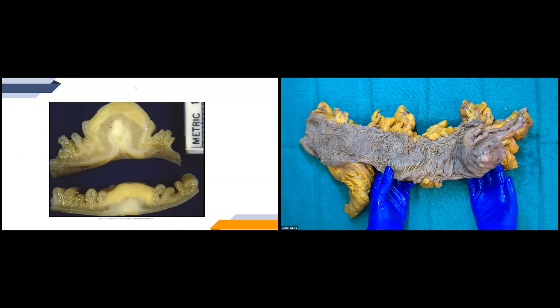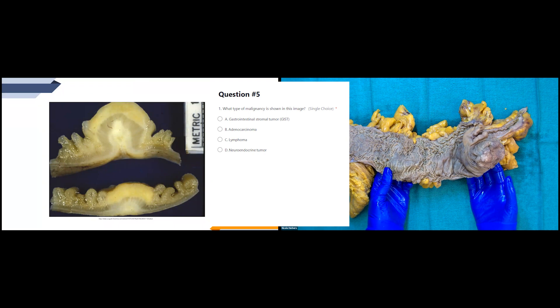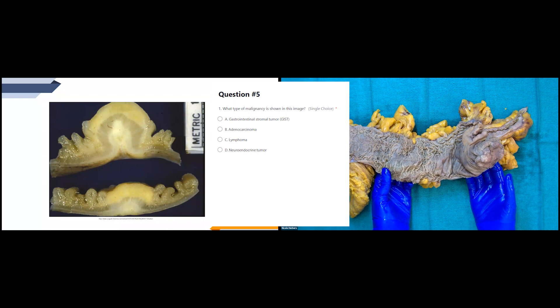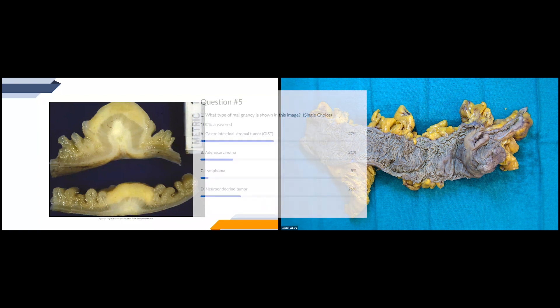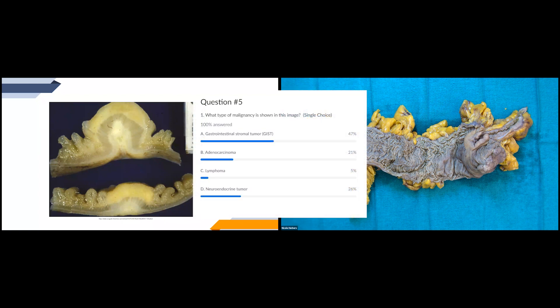Here's our next example, and I'll bring up a polling question for this one. The correct answer is actually a neuroendocrine tumor. What gives it away is really that yellow appearance of the mass — neuroendocrine tumors typically present with more of this very yellow kind of appearance. A GIST is extremely rare in the colon; the most common site for it in the colon is actually the rectum, and rectal GISTs make up approximately five percent of all GISTs.